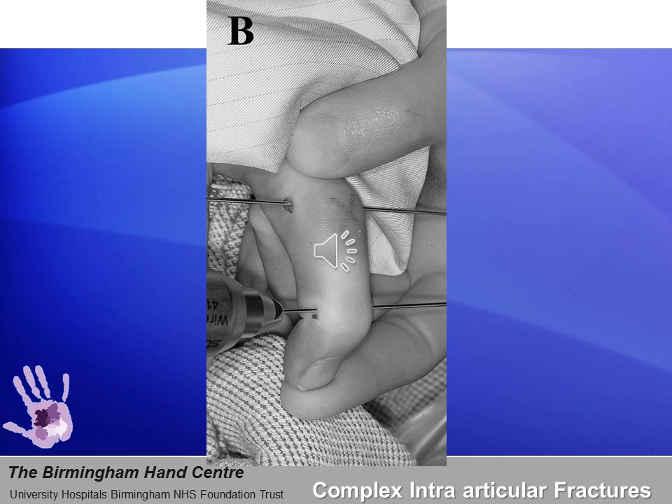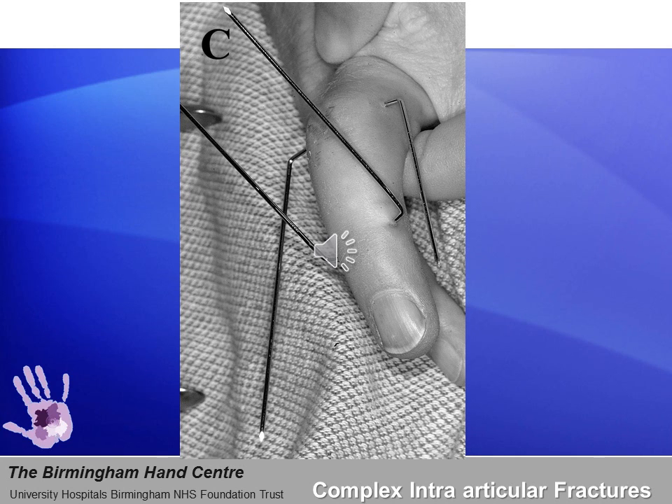It is important to locate the axis under fluoroscopy and ensure the K-wire is at a right angle to the long axis of the proximal phalanx and is parallel to the floor. The second wire is inserted parallel to the first wire in the neck of the middle phalanx, again preferably at the midpoint. Exact positioning is less critical as long as it remains parallel to the first K-wire, since any loss of parallelism will produce angulation and rotational deformity at the fracture site.